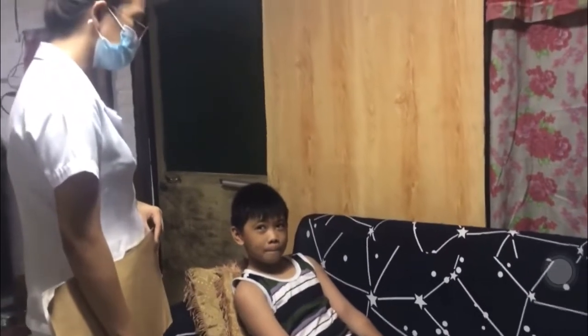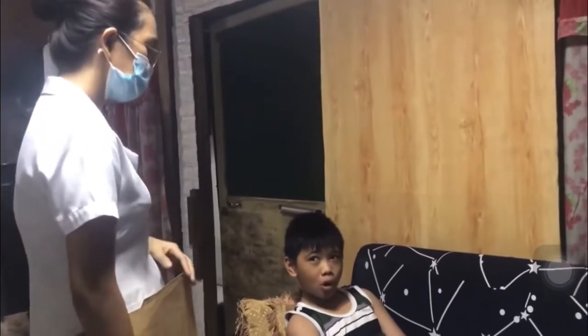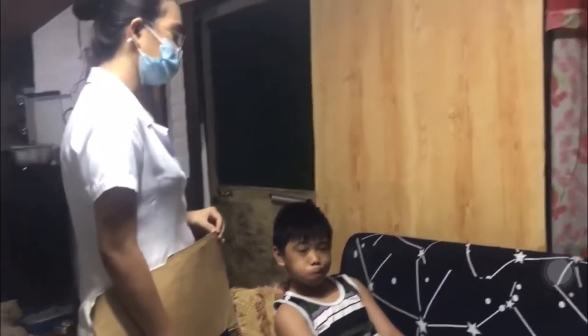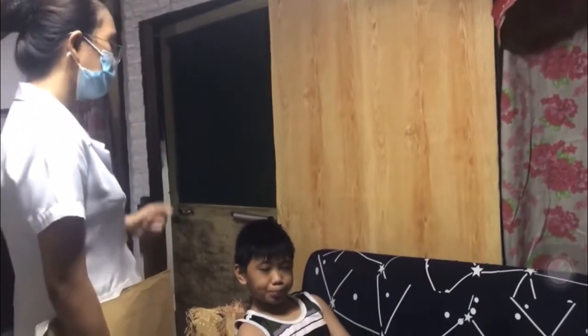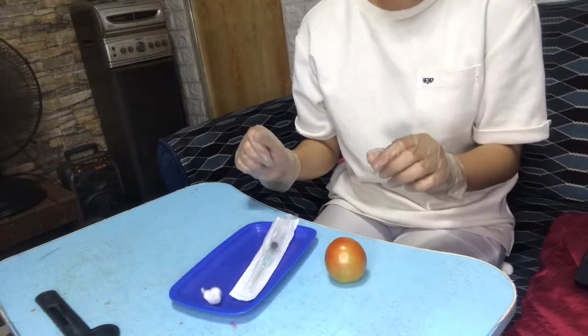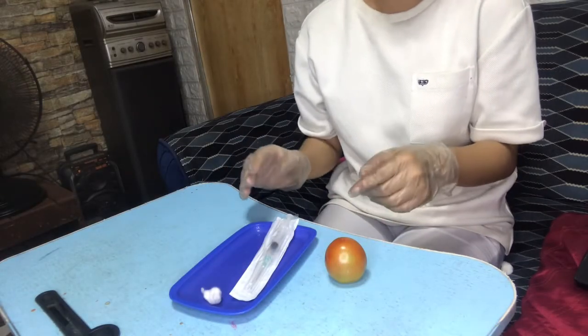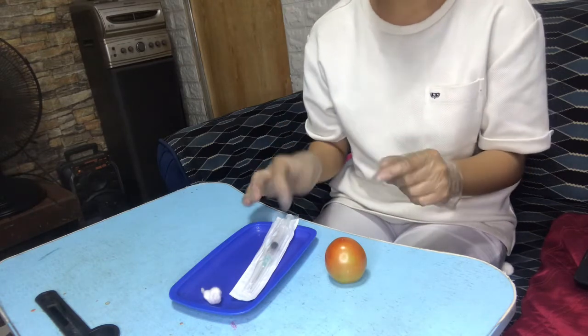Sean Christopher Morales. Thank you so much, sir. Do you still have any questions, sir, with regards to our assessment? No. Alright, thank you so much again, sir. After this, sir, I will be performing the procedure right away. Okay, thank you. So next, we're going to do the subcutaneous medication. Let's inject the medicine now.